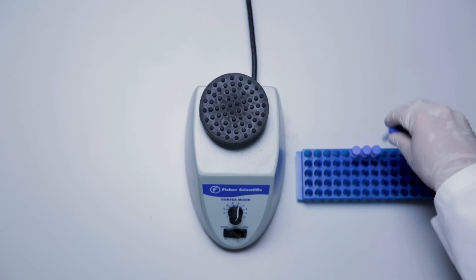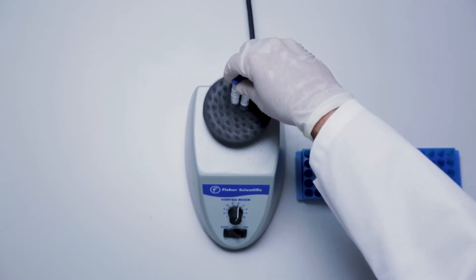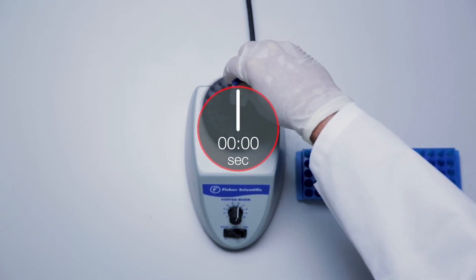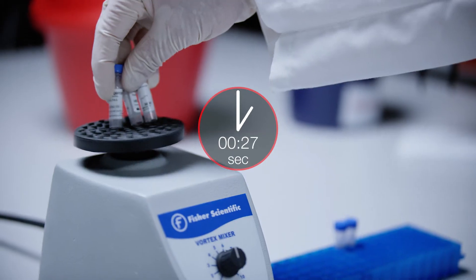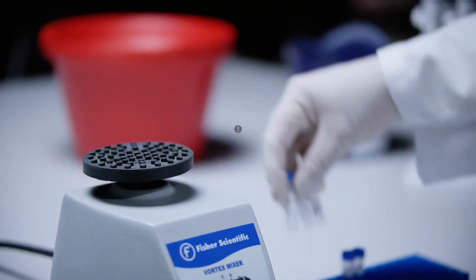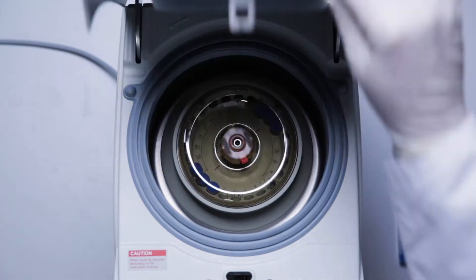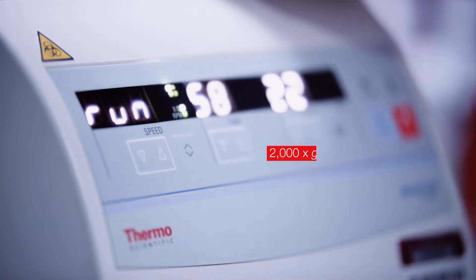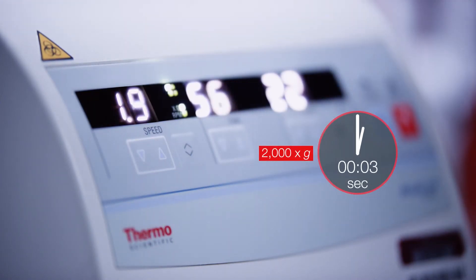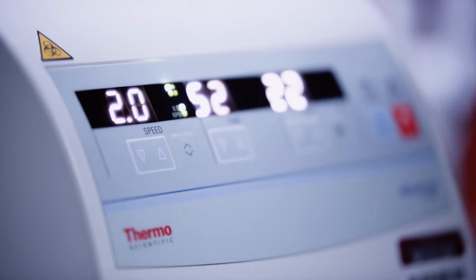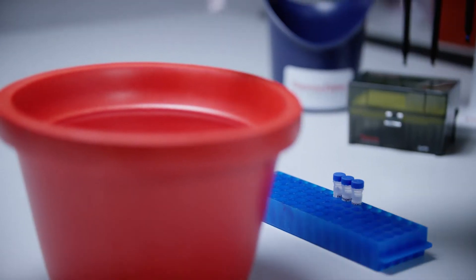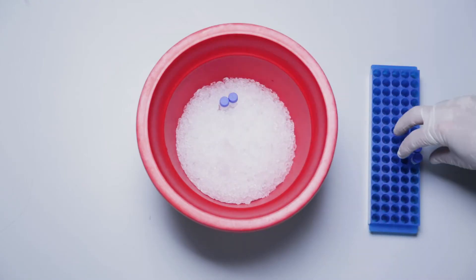Vortex the five antigen standard vials at high speed for 30 seconds. Centrifuge at 2000 g for 10 seconds to collect the contents at the bottom of the vials. Incubate on ice for 10 minutes to ensure complete reconstitution.